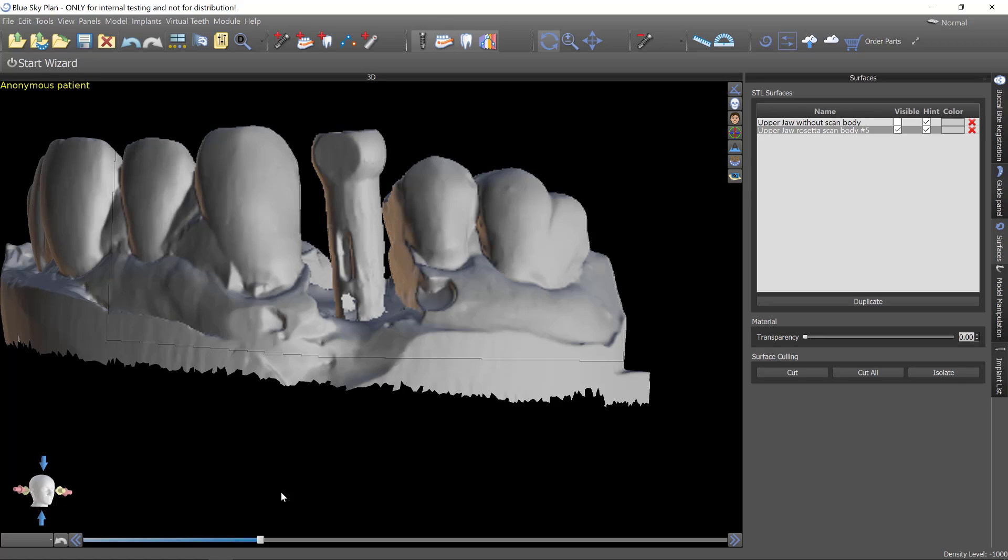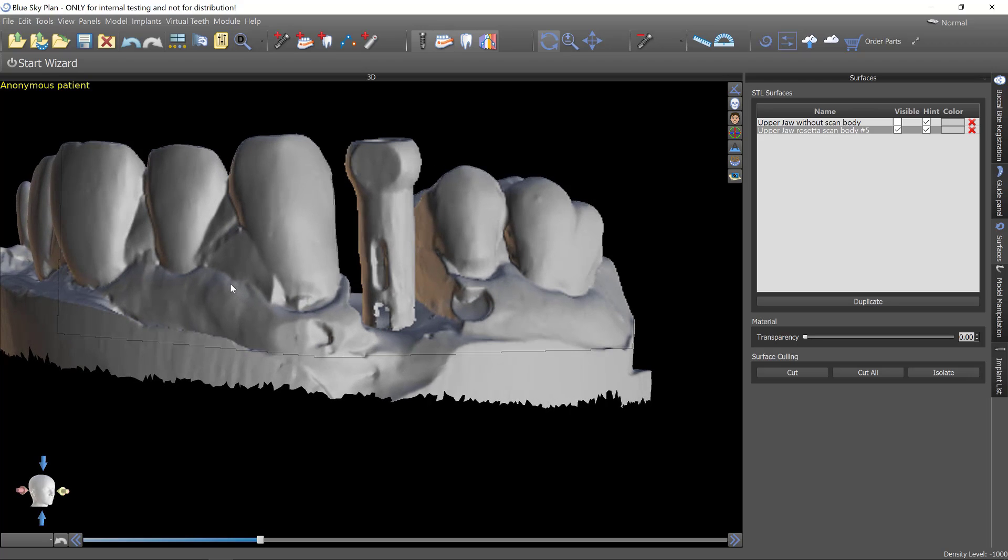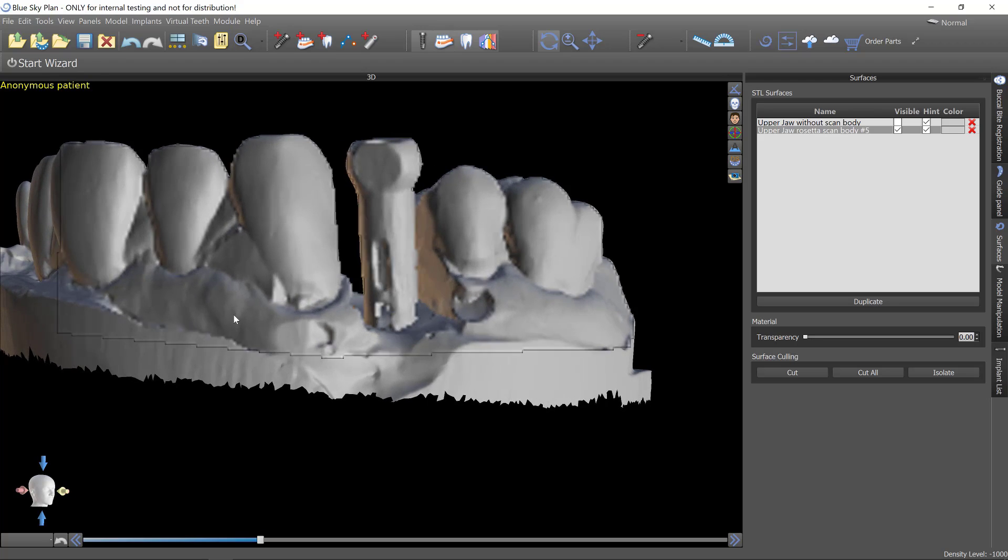In this video, I'm going to show you some of the early functionality with the CAD program that we're developing within Blue Sky Plan. This is definitely not in its final form. This is just an early alpha version, really.